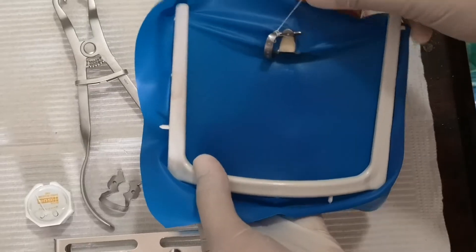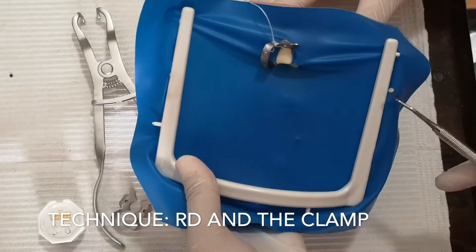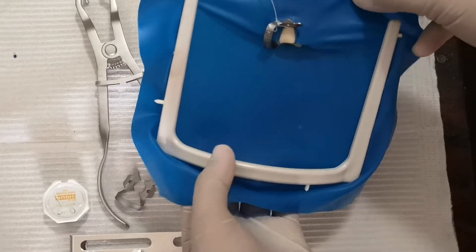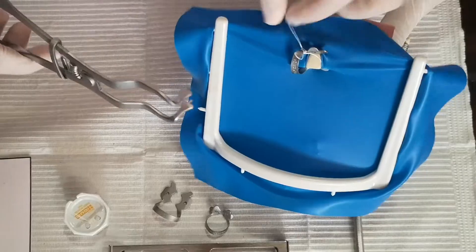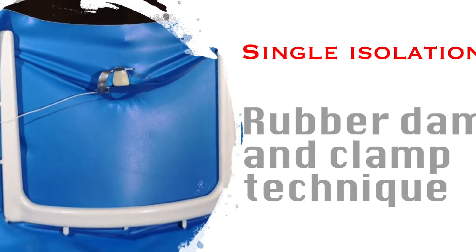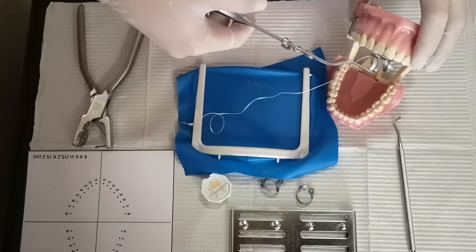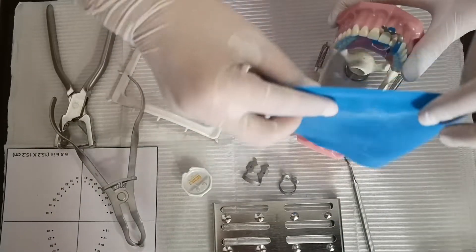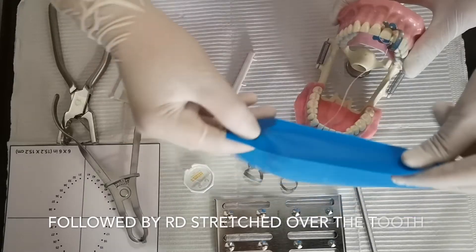You have now isolated the maxillary central incisor. Nowadays, they suggest that part of the nose should be covered. If part of the nose should be covered, then the hole should be made farther from the edge of the dam. Also make sure that the dull side is facing the operator and the shiny part is facing the mouth.